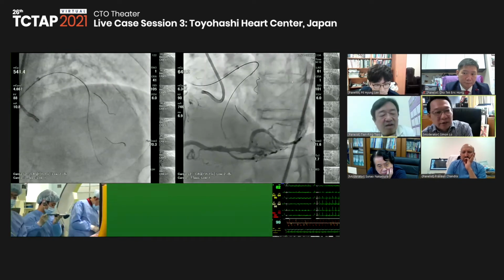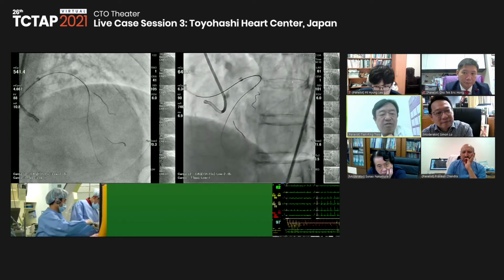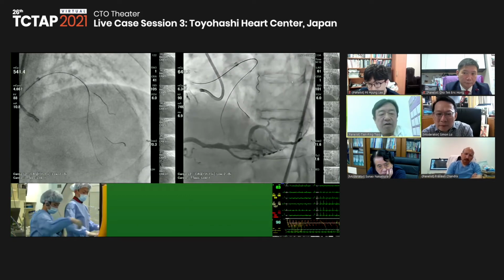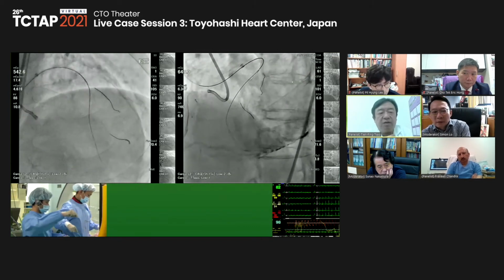Yeah, I still prefer single stent. So after the recanalization of LAD, and maybe after stenting, and see how the diagonals are. If the flow of diagonals are not good and the size is reasonable, then probably I use two stent or use DCB.